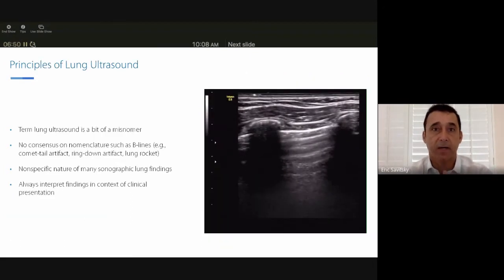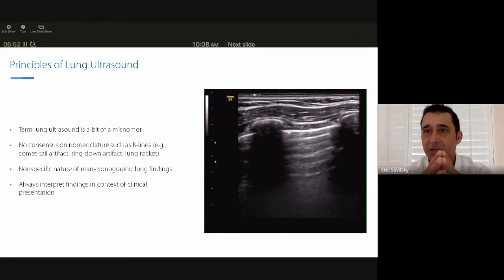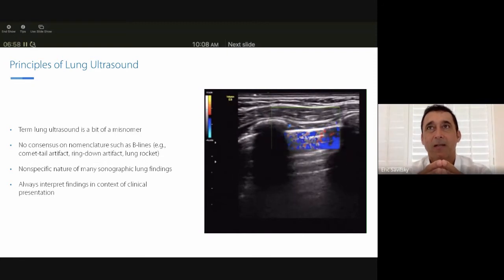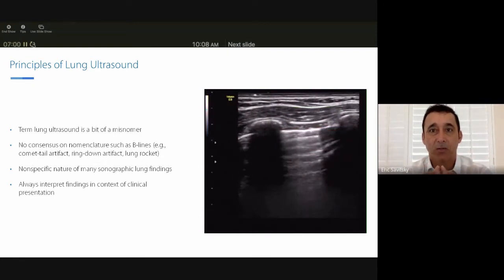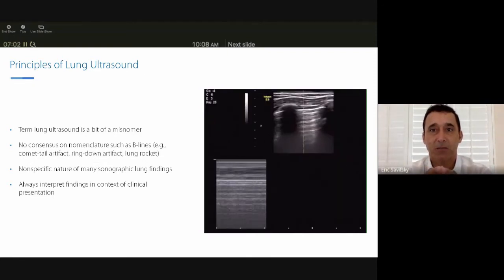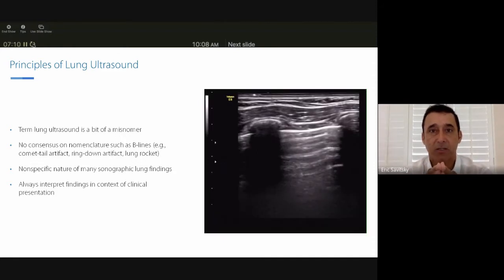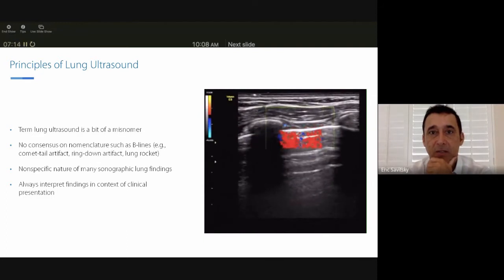course with everybody. So, to start with, pediatric lung ultrasound, the name of the course, is in some ways a misnomer. In a normal patient, you're not going to see the lung. The reason is your lung is aerated and air is going to block the ultrasound signal. So for the most part, in a normal patient, what you're going to see is what you see in this image, where you see soft tissue, you see rib shadows, and you're going to get a hyperechoic cortex here.